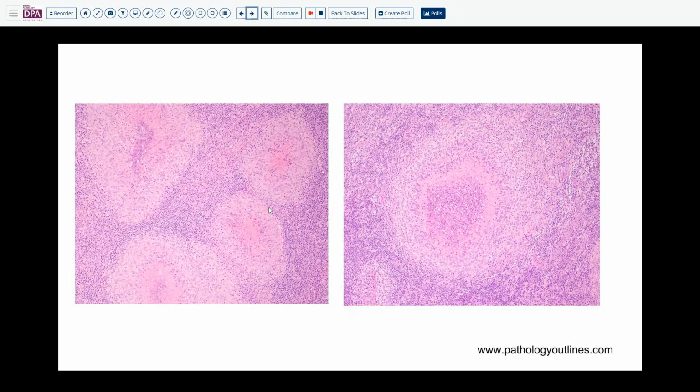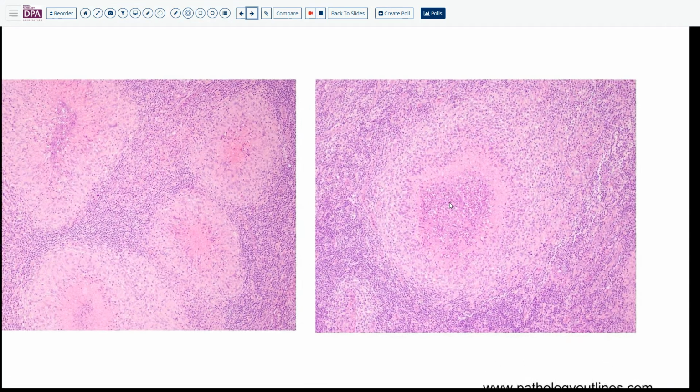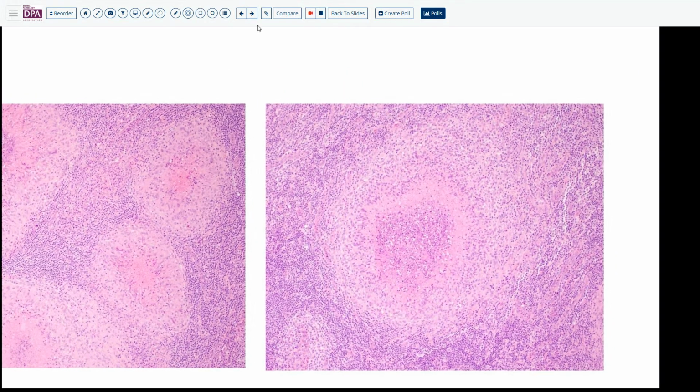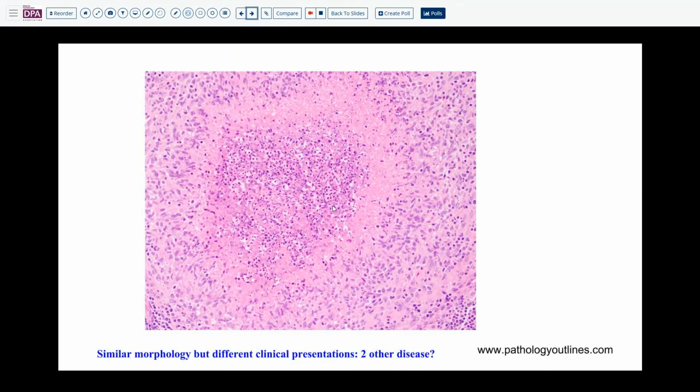In the higher image, we can see the histiocytes palisaded, and then some neutrophils and a necrosis area. In an even higher image, we show this characteristic necrotizing granuloma pattern, with neutrophils inside the necrotic area.